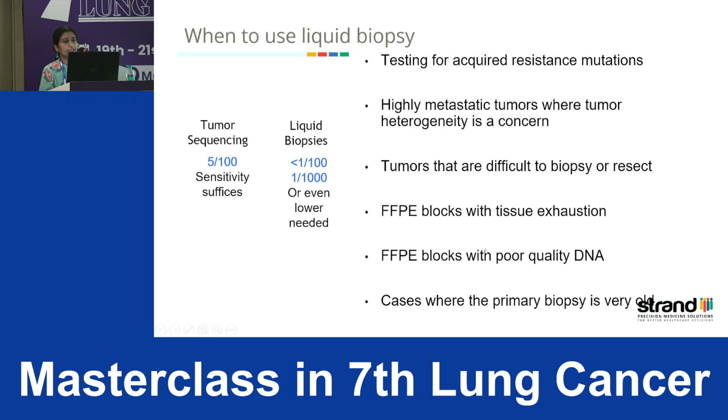But the thing to remember really is that when you have tumor sequencing in normal, you have a sensitivity. Most NGS assays have an LOD of 5%, which means if you can see 5 reads out of 100, then that's something which you can call out reliably, and that's usually enough because driver mutations do tend to fix in the population, and you can see it. Now, what happens in liquid biopsy is the signal is really, really diluted because there are very, very few cells in the blood.